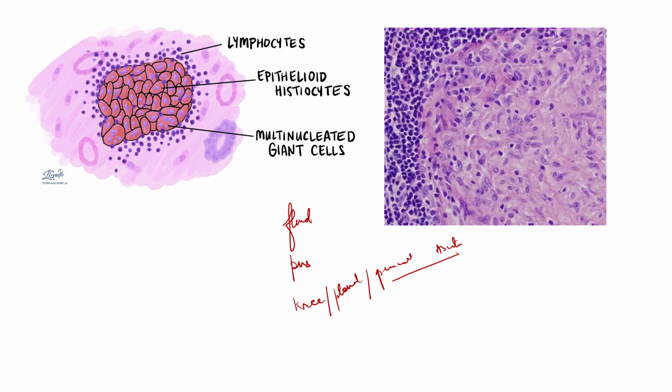Then you jump to benign reactive cystic diagnosis, differential diagnosis. Then you go for infections, and then you go for malignancy.